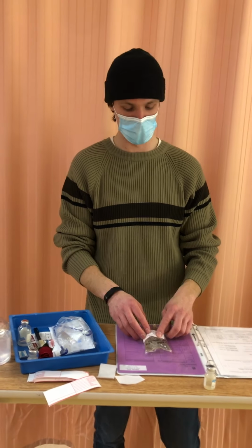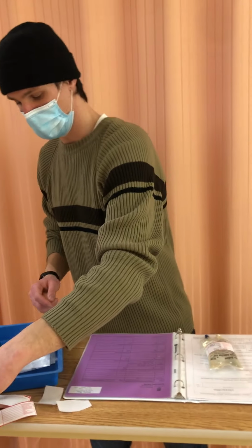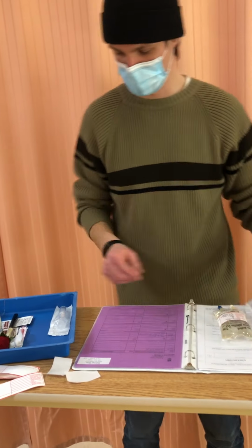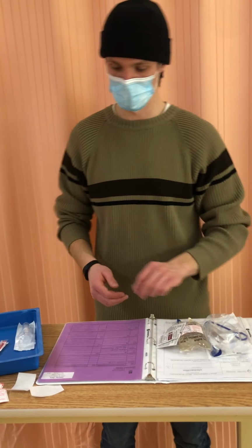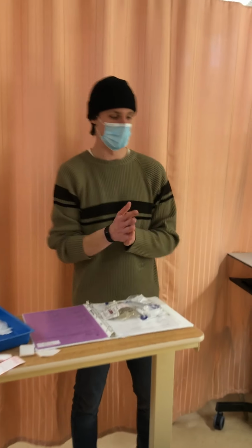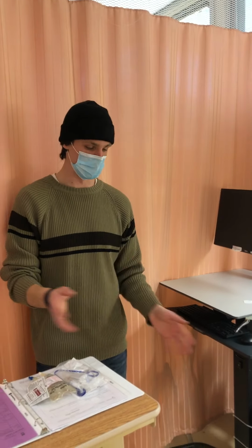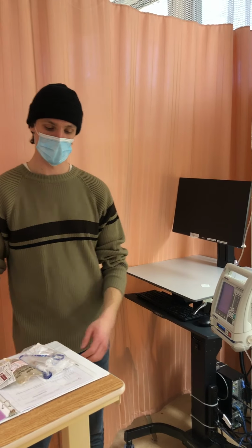So now I can go ahead and bring everything to the bedside. So I'll need my Minibag, I will need my secondary kit, and some alcohol swabs, and I'm good to go to the bedside. So I go to the bedside, knock on the door, wash my hands as I walk in, do a little safety check, introduce myself, say hi, my name is Tom, I'm going to be your nurse today.